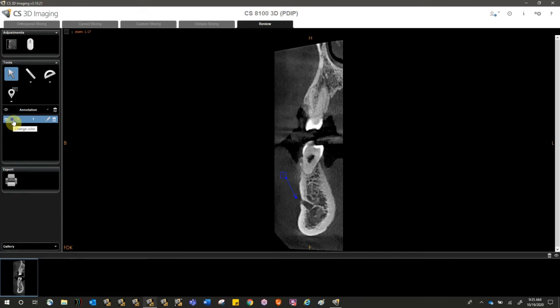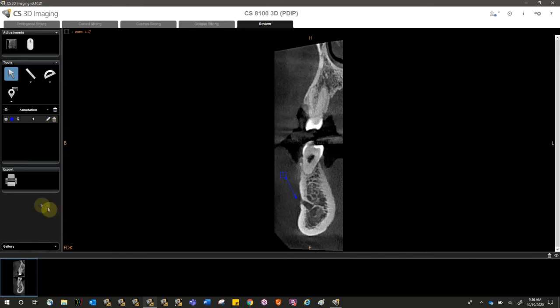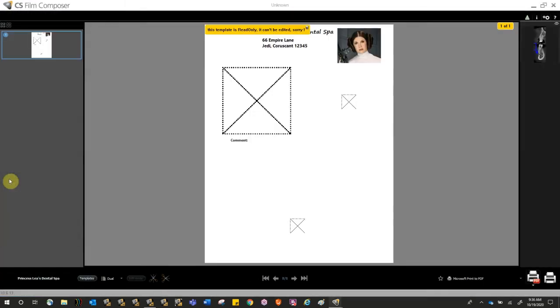At this point, once you've made all your annotations that you want to on this DICOM slice, you can then export it to your film composer. This is going to launch up your reports tab. You can have your own templates. You can make your own templates. There's going to be tons of other templates you can pick right here in the bottom left under templates. And then on the left-hand side is where you're going to find your gallery with all of your snapshots.